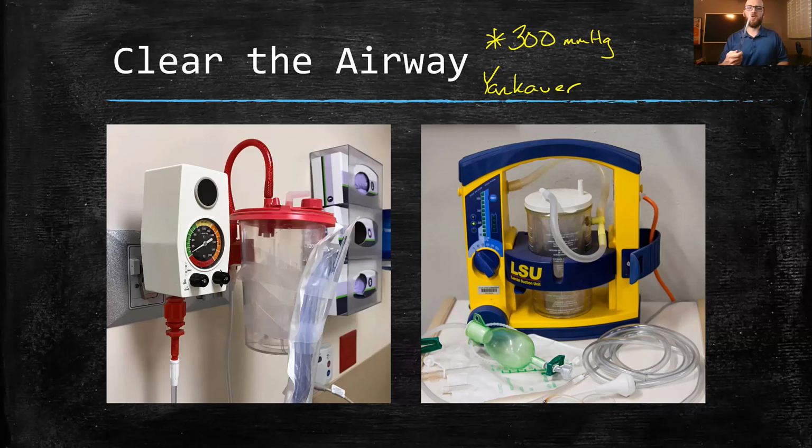So that's a more standard one, with a little bit larger of an opening than the little flexible catheter ones. So it works better for thicker secretions, maybe some vomit and stuff like that. Sometimes it'll get clogged and you may have to loosen something as you're trying to suction the airway. But these rigid tip, tonsil tip catheters, these hard plastic ones, don't really bend compared to the really flexible suction catheters.